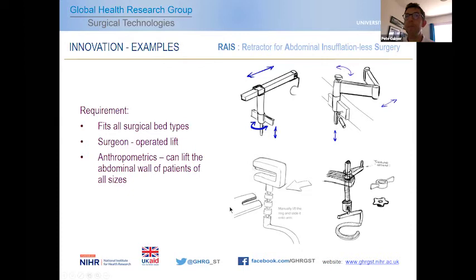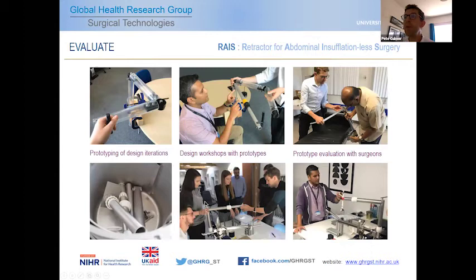So we go from these sketches all the way through to producing fairly early stage prototypes. Using plastic tubing and 3D printed parts, we mock up these different designs. Here you can see an early prototype of a system using a hinge joint to allow us to move across the workspace. And this system here has a slider instead of that hinge joint. So we played with different mechanisms, but crucially, we didn't just do that as an engineering community. We opened that up, and you can see us here with Dr. Ganaraj, with Noel. We've done the same kind of evaluations with Anurag and Lovanish, and we've got feedback on how these designs might work in the operating room as well as in a lab environment that we traditionally inhabit. So we're really trying to understand the usability and how these might function in real life.